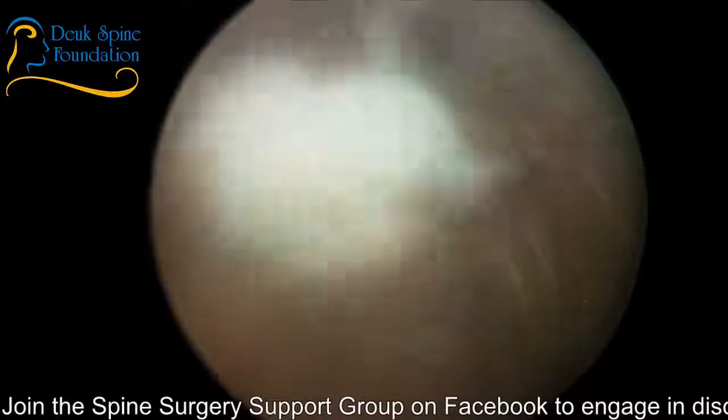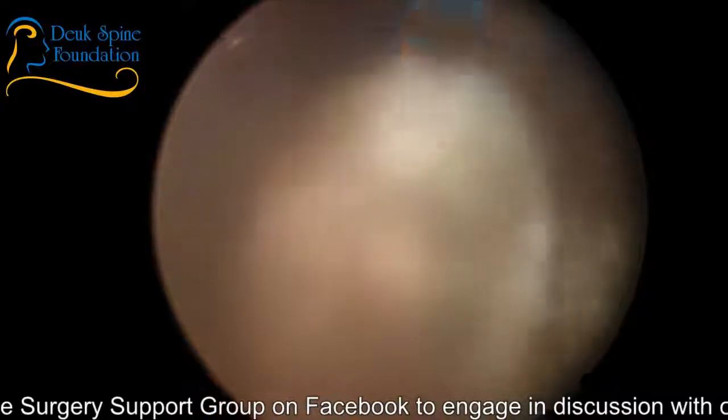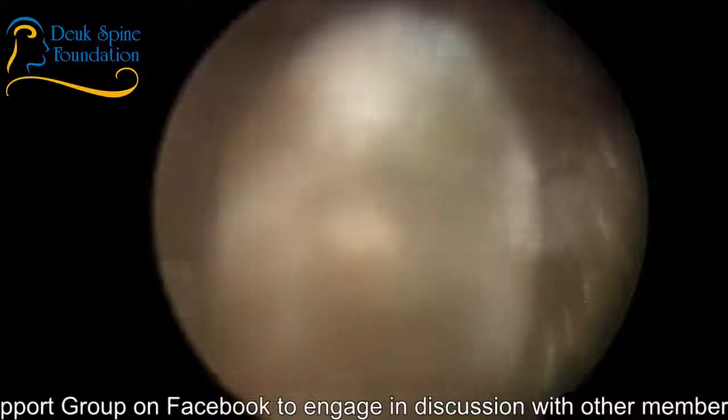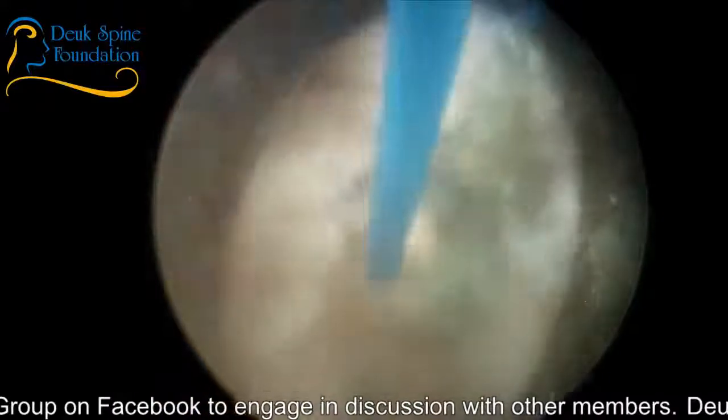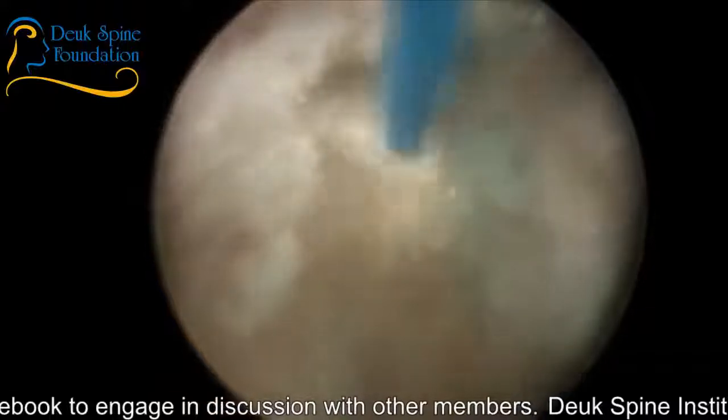There are other lasers that are cheaper. There are other types of lasers, like CO2 lasers, for example, but they don't do this properly. So I use only a holmium YAG laser.